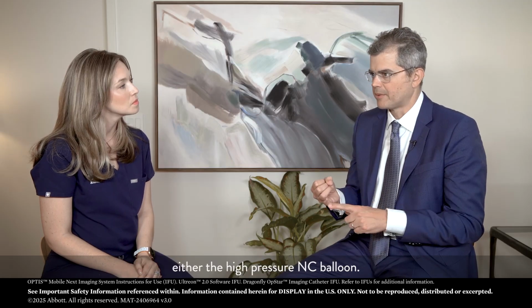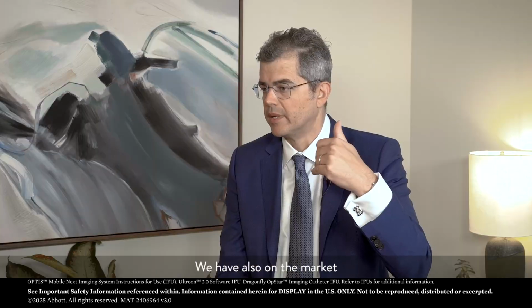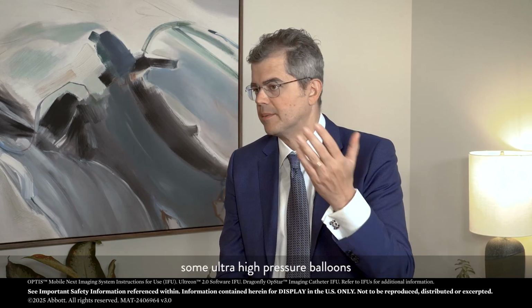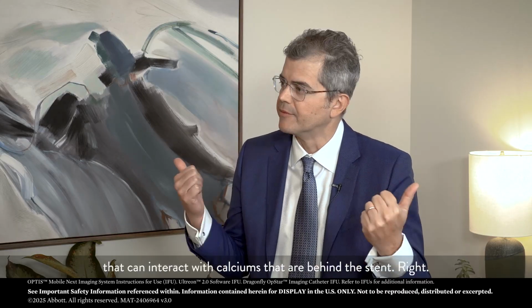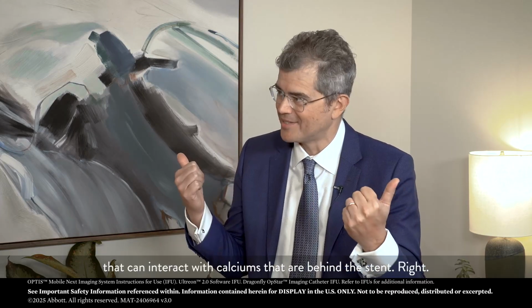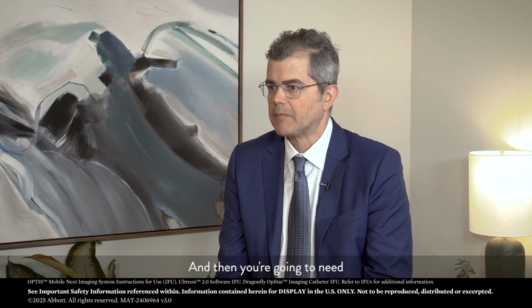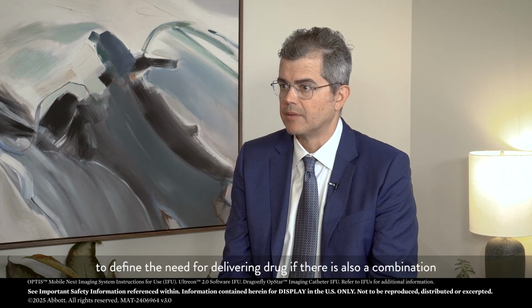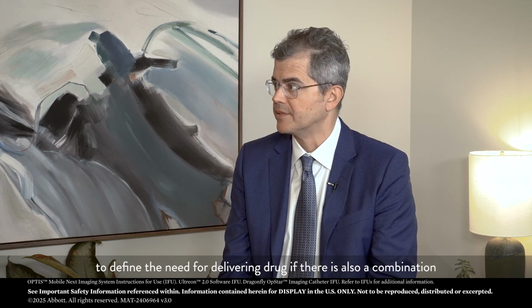So how do you do that further expansion? Either a high pressure NC balloon. We have also on the market some ultra high pressure balloons like the OPN balloon that can interact with calciums that are behind the stent, right? And then you're going to need to define the need for delivering drug if there is also a combination of excessive tissue on top of it.